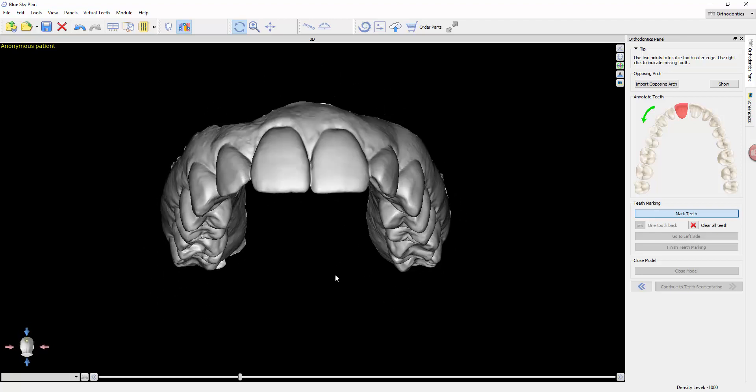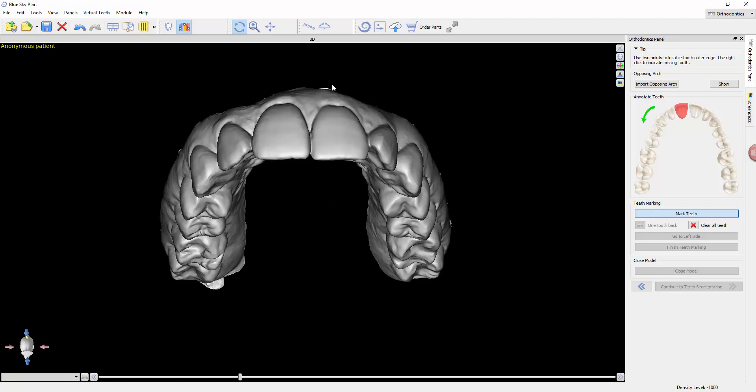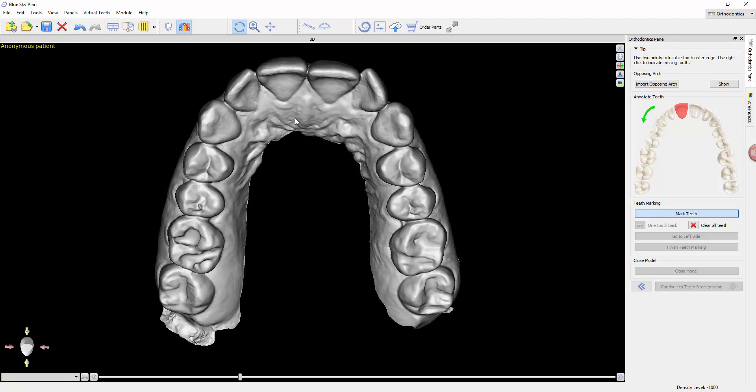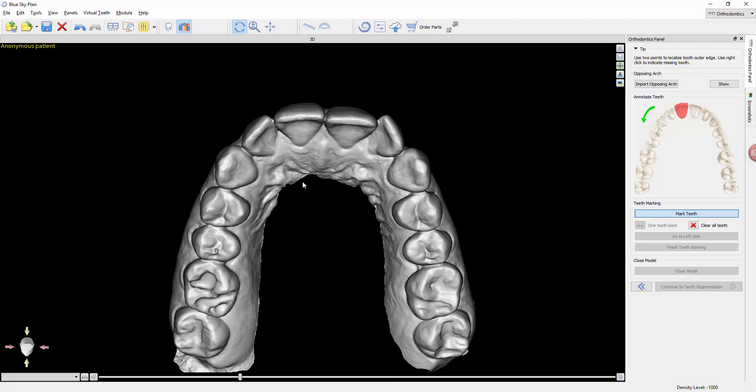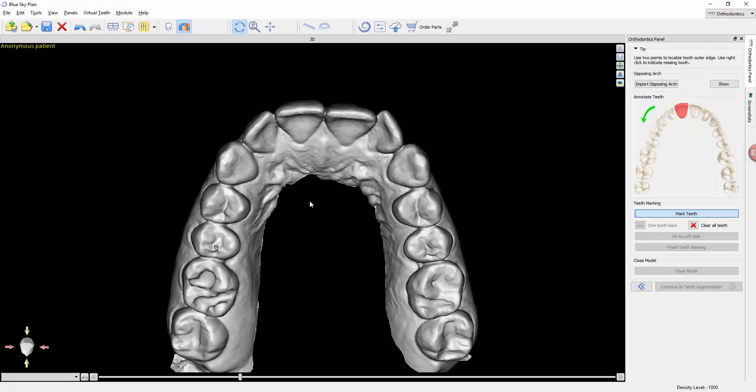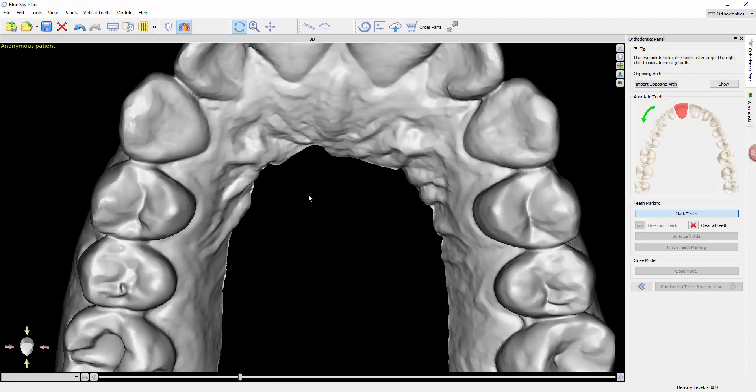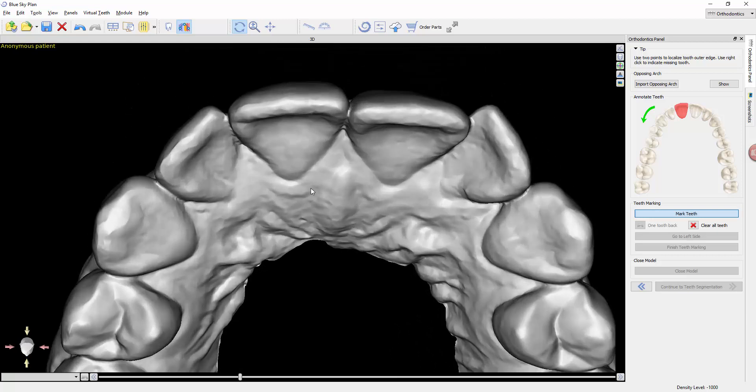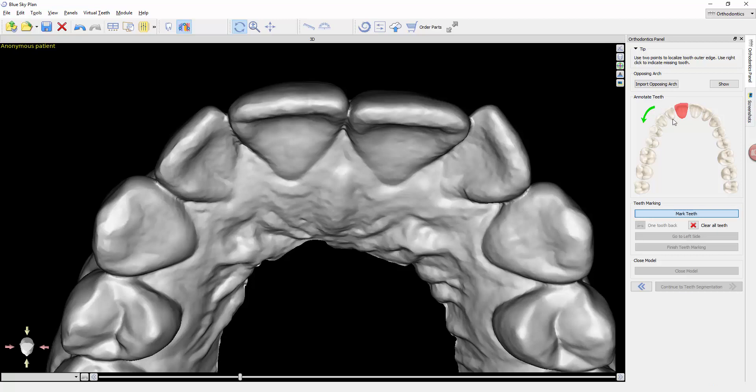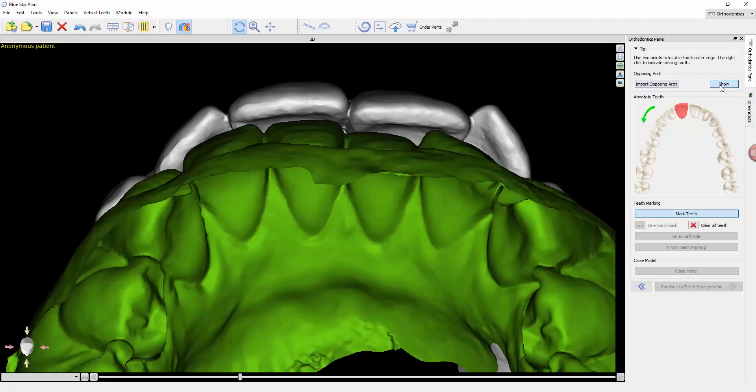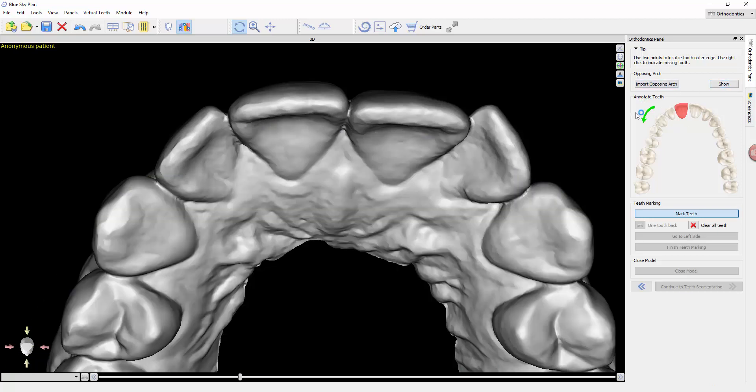This step is going to tell the software a few things. First of all, if you look, it shows you we've already imported the opposing, we can show and hide that. But the first step is to annotate the teeth.